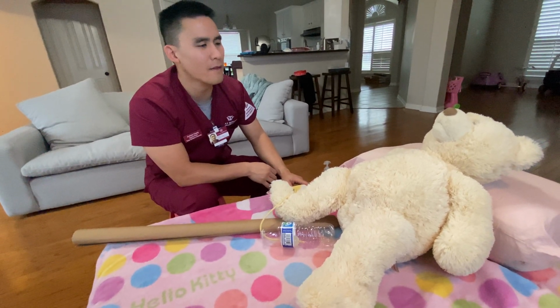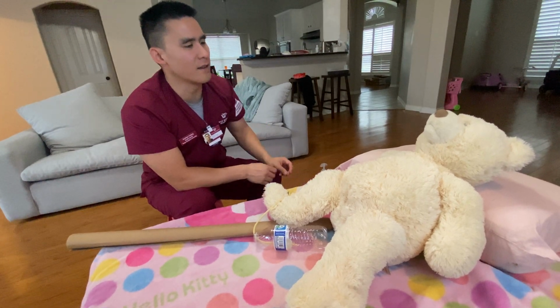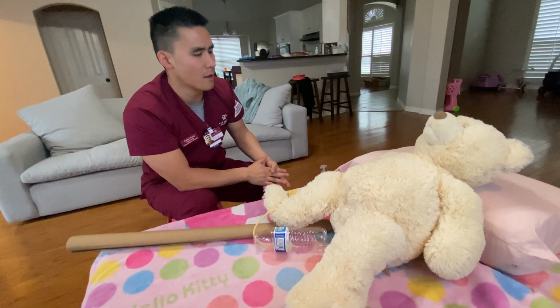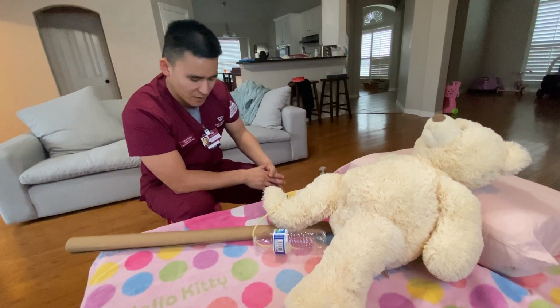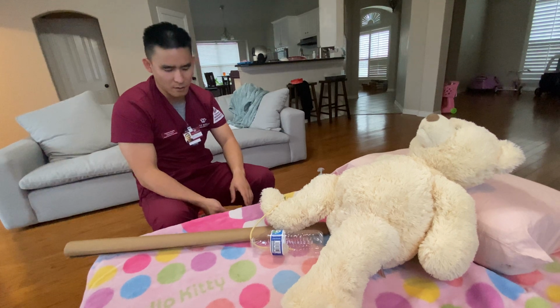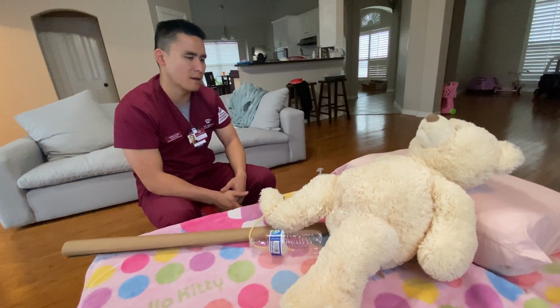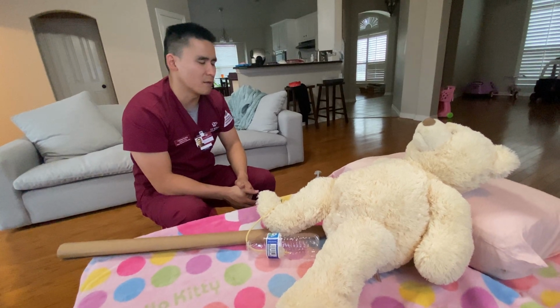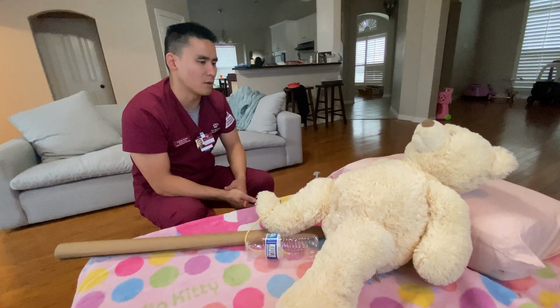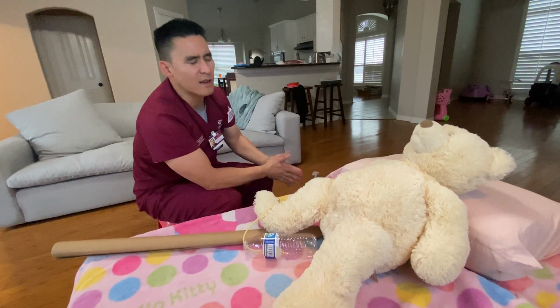I'm going to put your call bell next to you. If you need any assistance, please let me know. And then I'm going to check again the tube just to make sure. I don't see any kinks in the tubing. Looks like the urine's flowing by gravity. So it looks like we're good here. If you have any questions, please let me know. But I'm going to do hand hygiene. And we're done for the day.